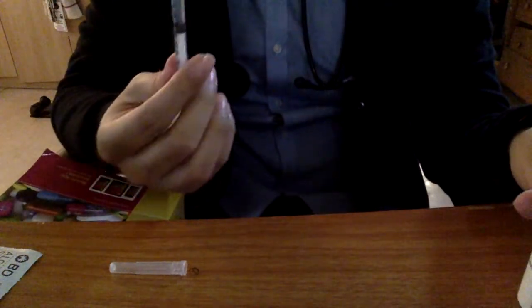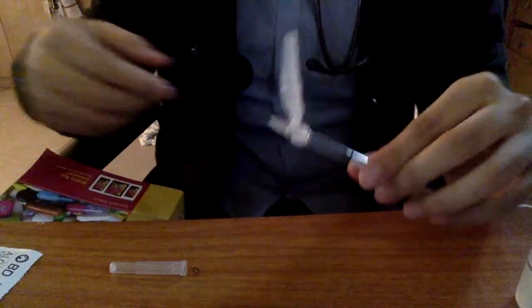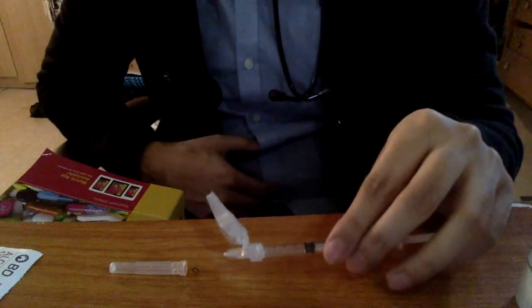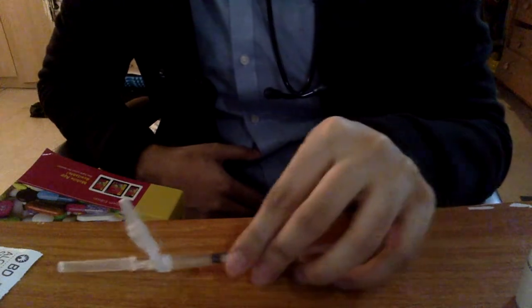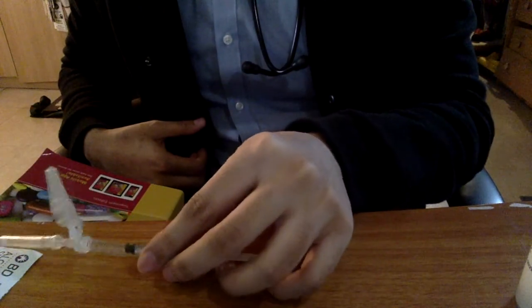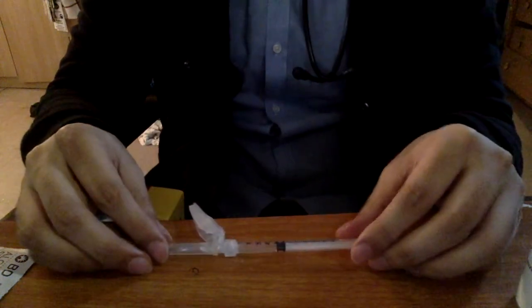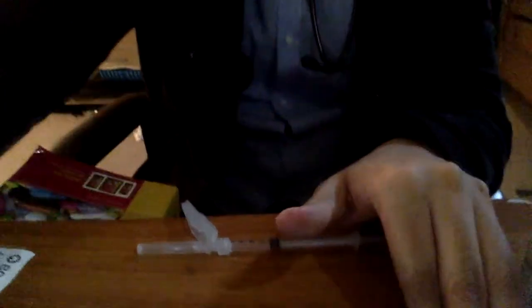We're going to observe any air bubbles, give it a couple flicks. Doesn't look like we need to expel any additional air. We're going to do the one-handed technique to put the cap back on, just like this. Okay. Now we're going to secure the cap.